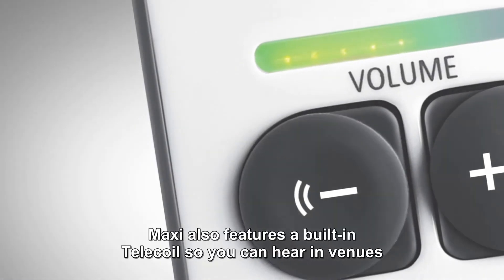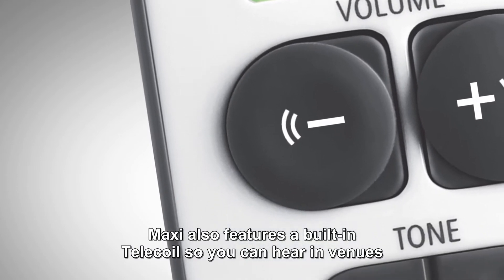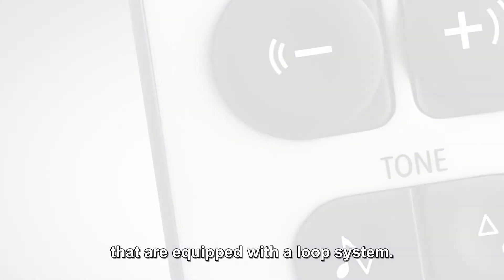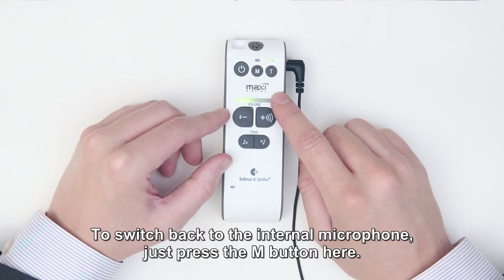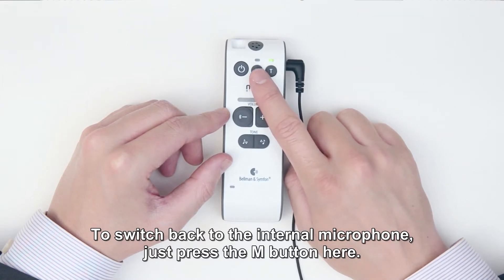Other features. Maxi also features a built-in tele-coil so you can hear in venues that are equipped with a loop system. Simply press the T button to activate the tele-coil. To switch back to the internal microphone, just press the M button here.